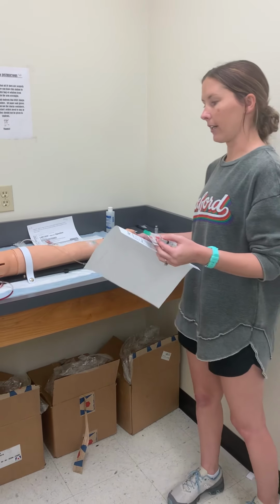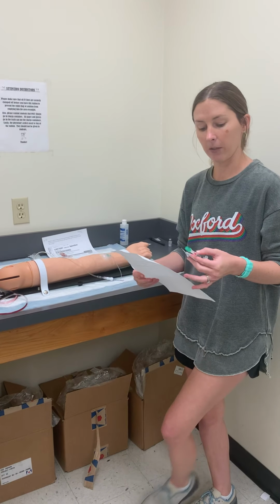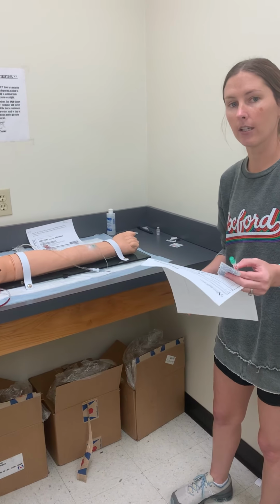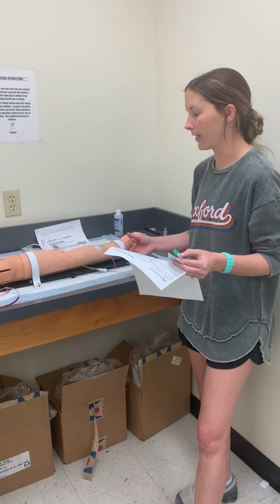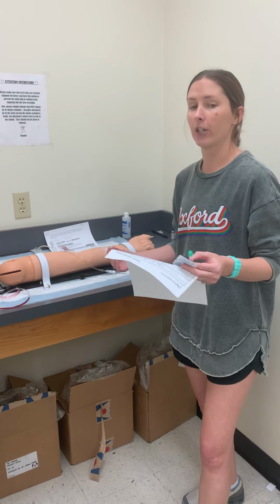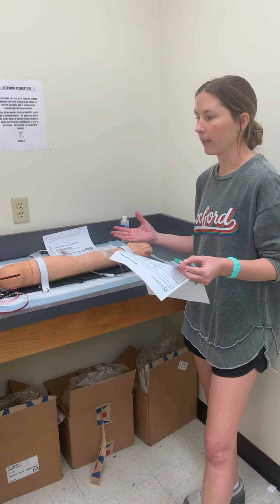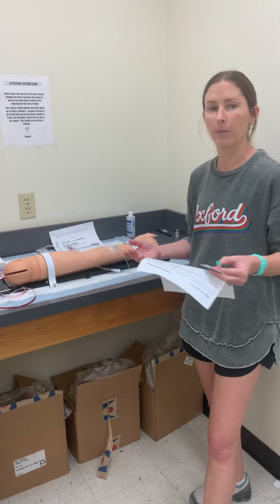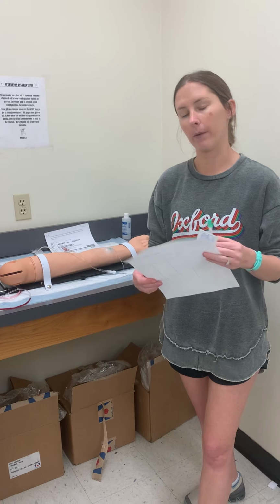I want to explain that the doctor has ordered for digoxin to be given, and this is an IV push medication. It requires no additional needle sticks. We are going to be administering this medication through your existing IV. I'll be administering over 5 minutes, so I'll be standing here with you the whole time. I'll be monitoring for any signs and symptoms, any adverse reactions, and I'll also be teaching my patient about any adverse reactions while I'm here as well.